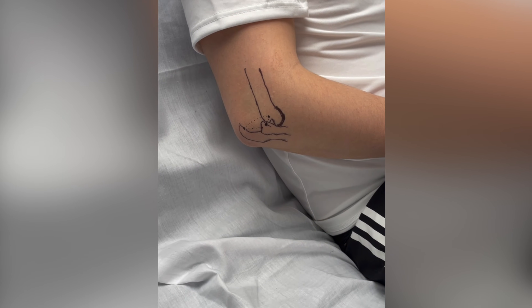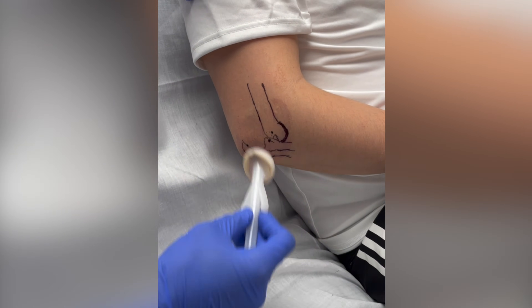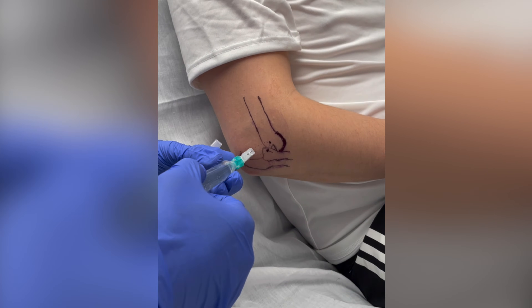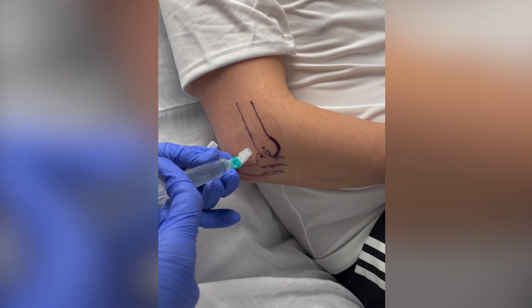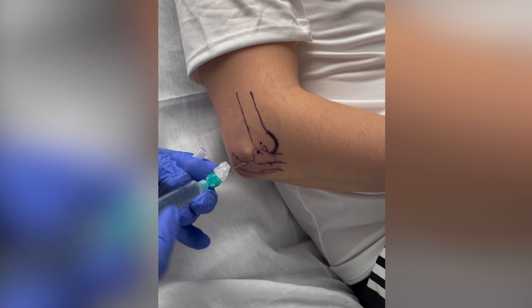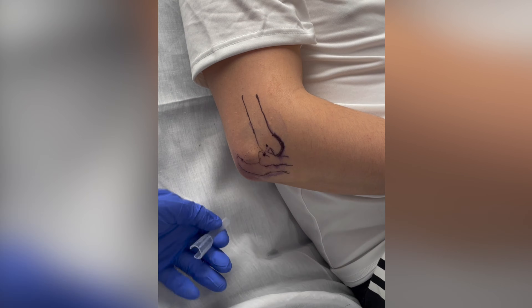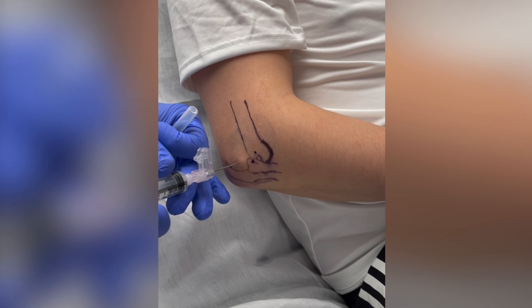This is a video demonstration of the elbow hematoma block. First, the lateral soft spot to the elbow is prepped with chloroprep solution. Next, the skin is anesthetized with a 21-23 gauge needle and a few cc's of lidocaine. A wheal of lidocaine is injected in the sub-Q tissue, and then an empty 10cc syringe with an 18-gauge needle is inserted into the lateral soft spot of the elbow, into the elbow joint.